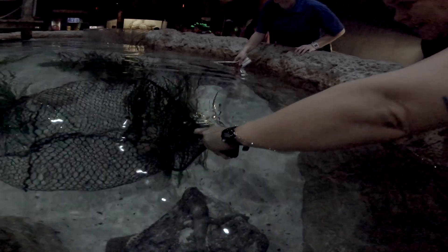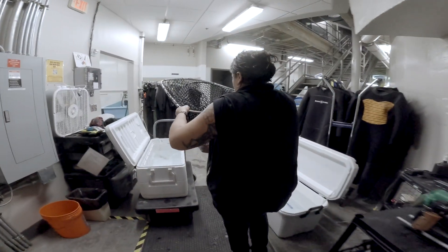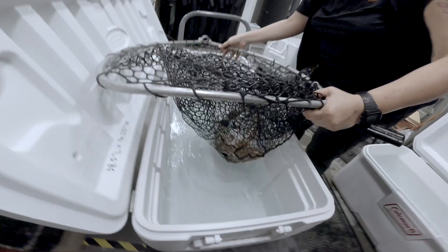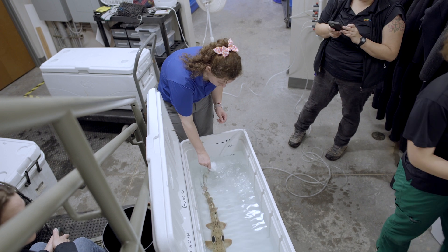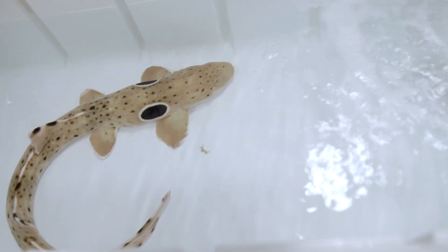To start off their exams, our aquarists will net the sharks out of our touch tank where they live normally. From there, they'll move them to either a holding tank or into a cooler that will induce them into anesthesia. Unlike our more land-based animals, sharks take in oxygen through their gills, so an inhalant anesthesia like we can use with some of our mammals and birds isn't going to work as well. So instead we put a drug into the water called MS-222 that they then take in through their gills to get them into a good plane of anesthesia where we're able to handle them safely and they're able to have the exam relatively stress-free.